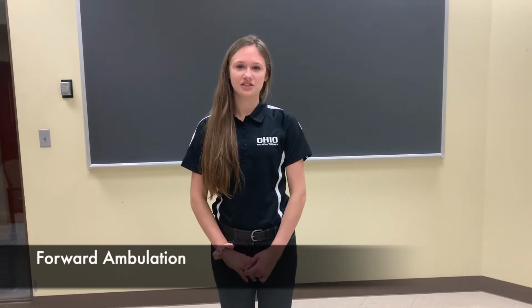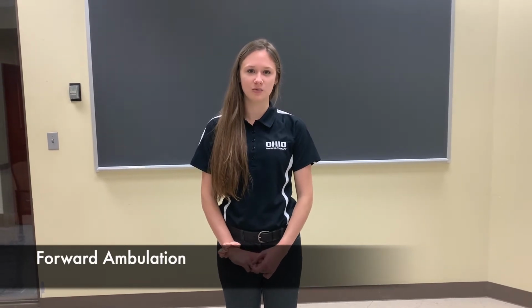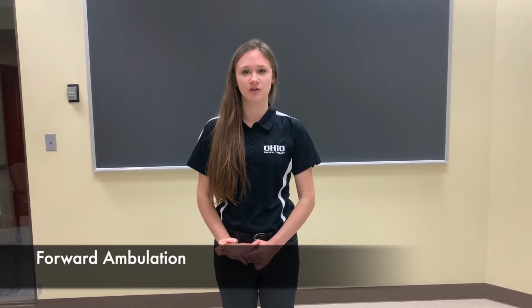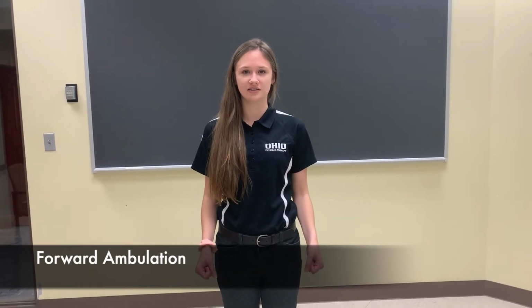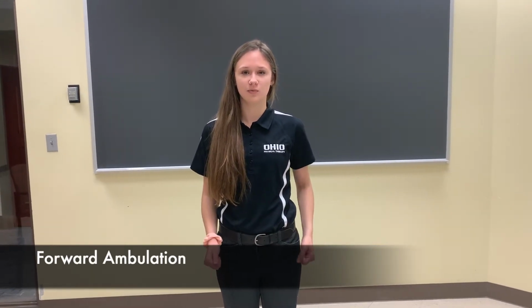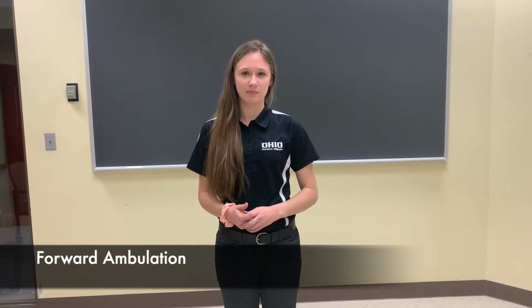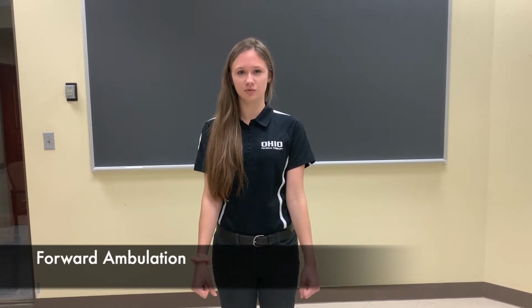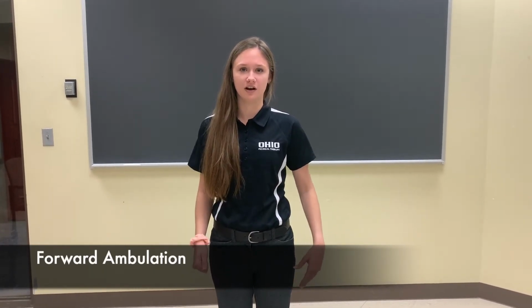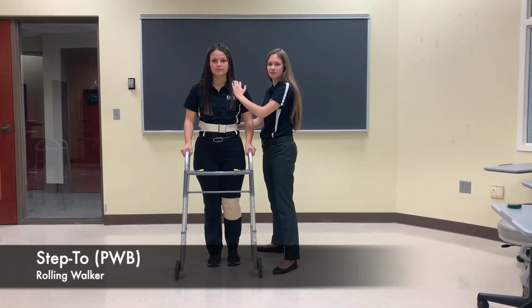For forward ambulation, the patient will begin by moving the walker one pace forward. For partial weight-bearing patients, the patient will first move the affected limb forward, pushing through the walker with their hands as much as needed. Then they will move the unaffected limb forward to meet the affected limb. For non-weight-bearing patients, the patient will place their full body weight onto the walker through their hands and move their unaffected limb forward. This is a step-to gait pattern.